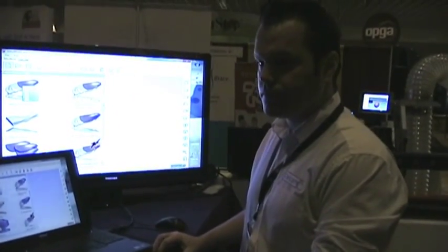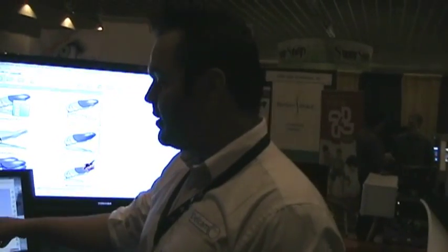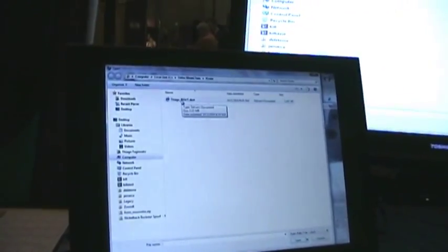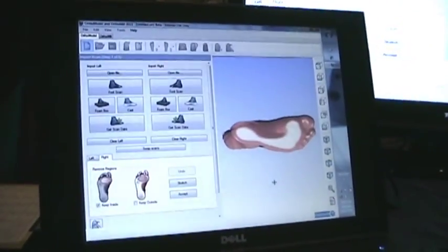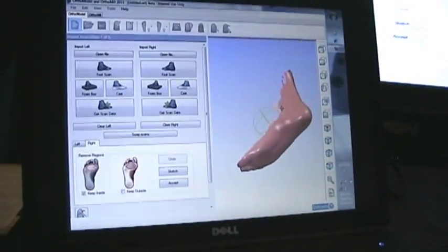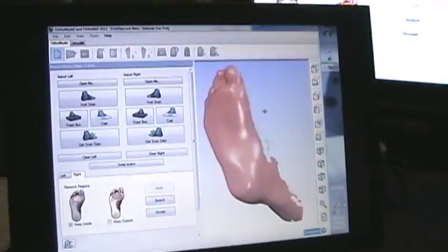Tiago, can you show the process from this point on? Since we have used a scanner, I'm going to design an anatomical orthotic based on the patient's foot shape. I have the option to open the file that we just digitized, which is my right foot. I'm going to say open, and OrthoModel is going to load the foot scan that was created in the iCube. We have the option to analyze the foot and look at the geometry.